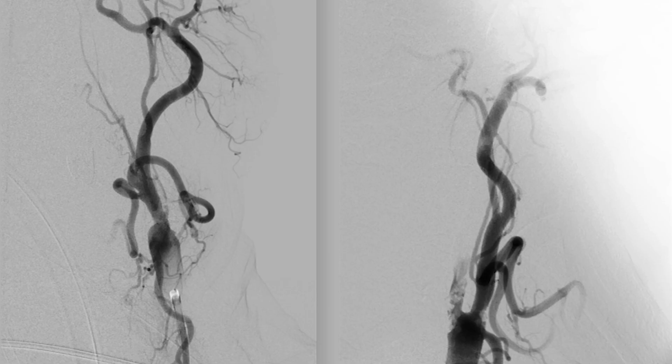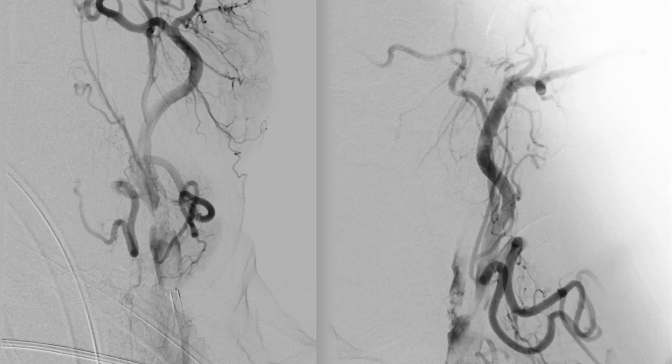In this case, as we can see, we have a high-grade stenosis of the cervical carotid and probably a thrombus hanging on the atheroma. From the CTA we knew that we had an intracranial occlusion of the M1.